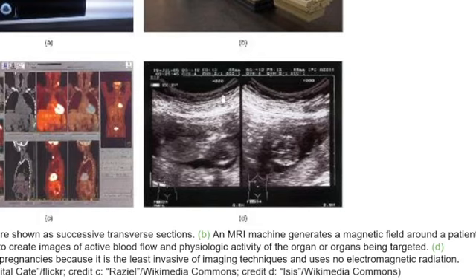This is the least invasive imaging technique, and ultrasound is commonly used to monitor pregnancy. By the sound of it, ultrasound uses sound waves to generate an image. So this is not really deadly.